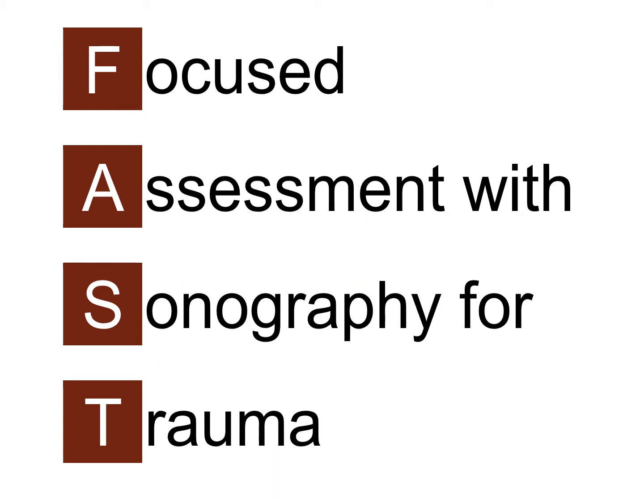So two things that point of care ultrasound people love are acronyms and mnemonic devices based on food for what things look like. So the FAST exam is one of our acronyms. It's one of those acronyms that was clearly thought of first, and then the words were found that fit into the acronym. So it stands for the Focused Assessment with Sonography for Trauma, which is just so clunky that it had to be done backwards.